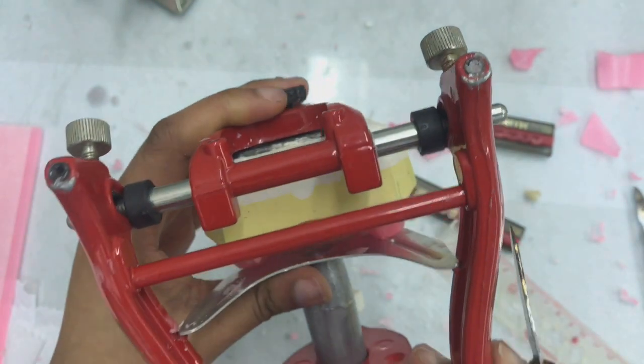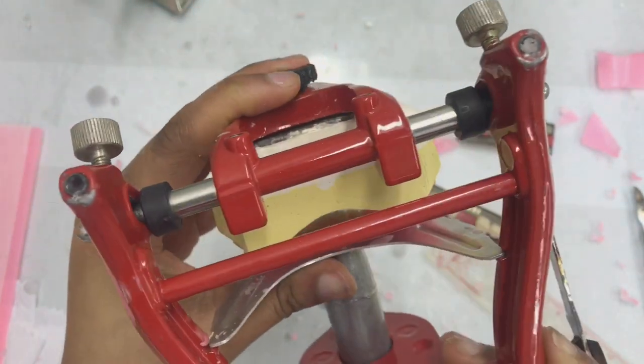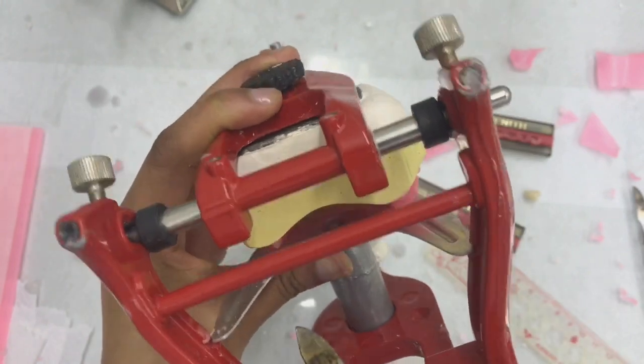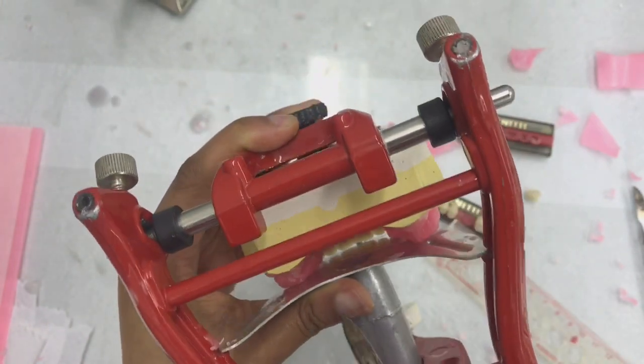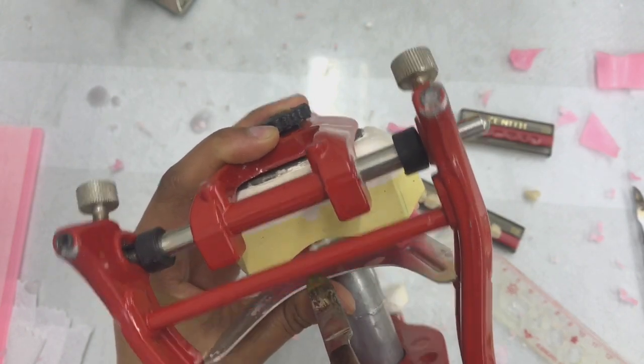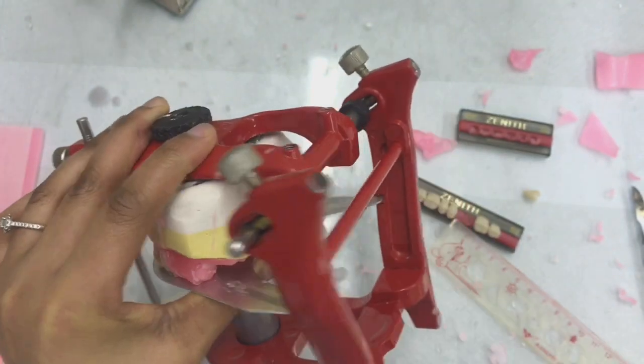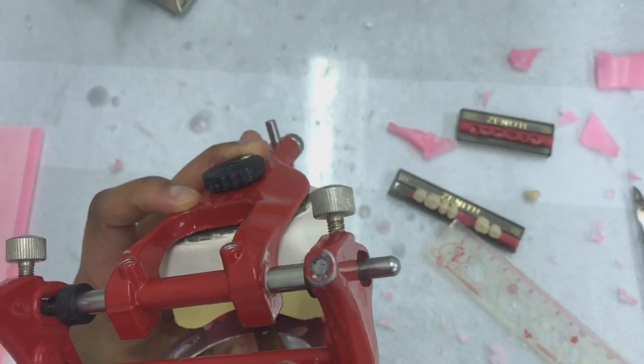What I then like to do is view my tooth from the lingual side. Okay, it's actually not that clear to you, but what I do is I use my instrument to lift up the lingual cusp from the occlusal plane.